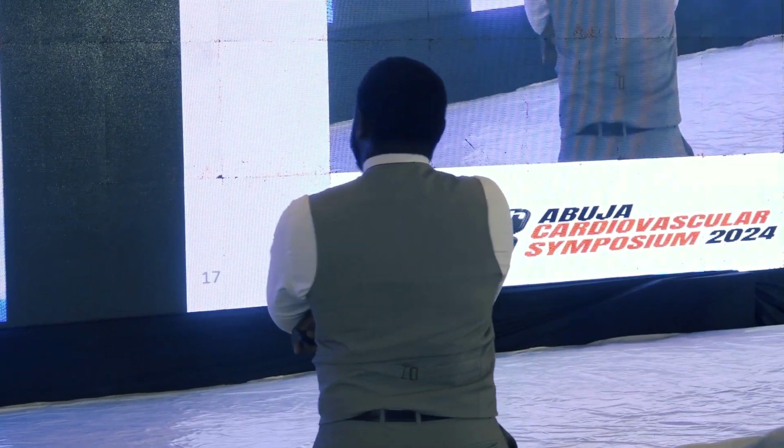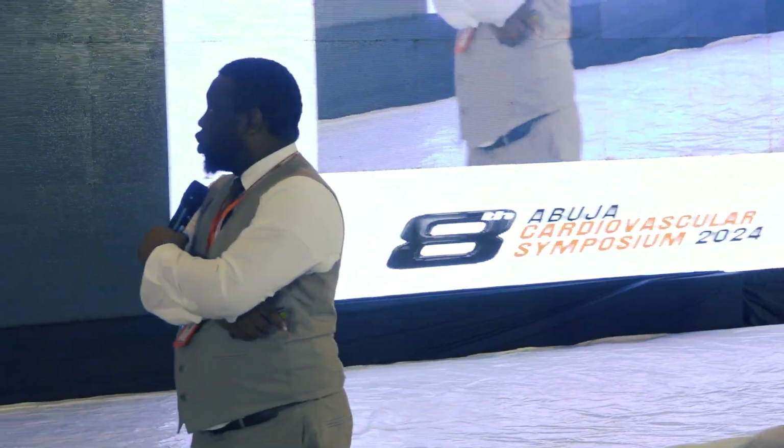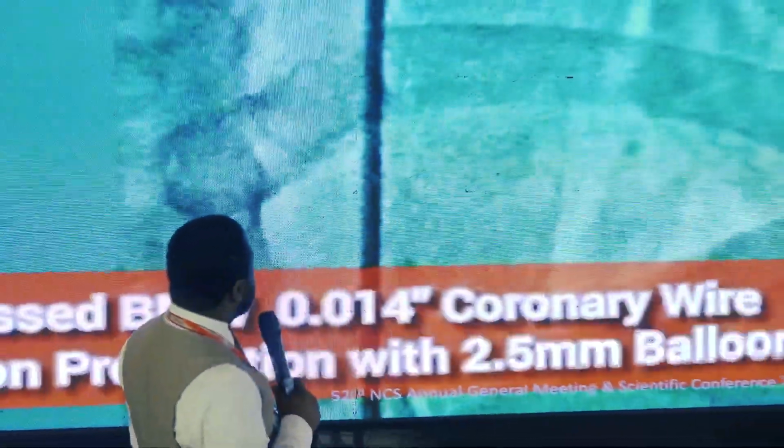Coronary angio, anterior STEMI, my ECG is not here. Patient came in, and then we did this. So this is a very interesting case, I remember, because they had to call me out. 100% occlusion. Can we see the 100% occlusion? Again, just like the previous one, something should have come across at that top. Can you see where that white line is? So that vessel is missing.